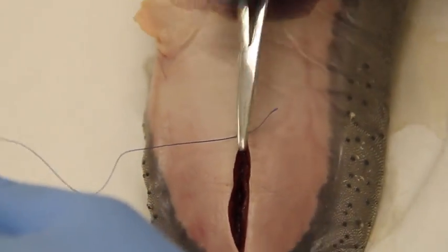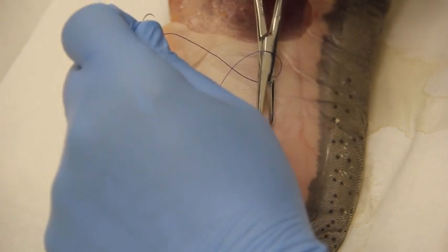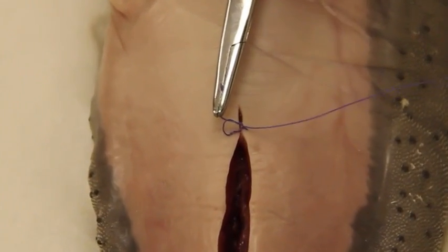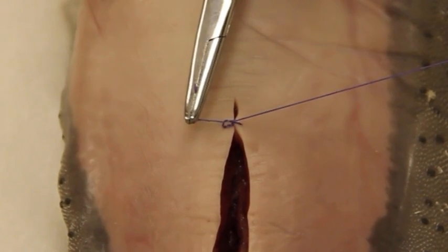Again, put it in between, wrap it once, grab it and again you need to come down flat but you have to pull away to the other side with your driver.